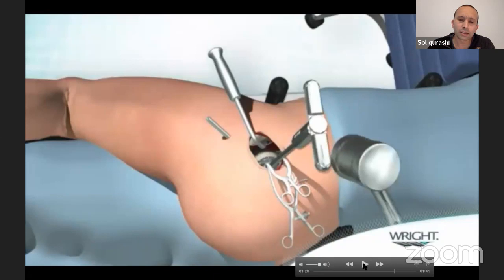Once you've done that, you put in the cup through the main incision. It's very, very easy to put screws in. In fact, it's a lot quicker putting screws into the cup through this technique than it is with the posterior approach. You just put in the drill and the drill guide through the cannula, and literally it takes about 30 seconds. You don't have to fiddle with the angled holder that keeps on slipping when you put it in or anything like that. So I always put screws in more for peace of mind, but you often get a very nice and solid rim capture cup. In terms of cup positioning, you see all the landmarks very, very easily, the TAL, the anterior, superior, posterior wall, inferior, the whole acetabulum pretty much.